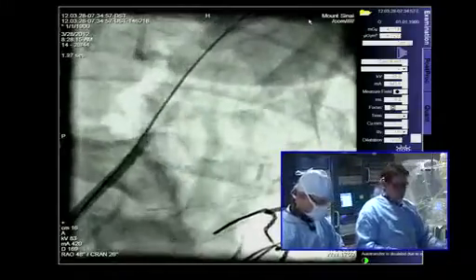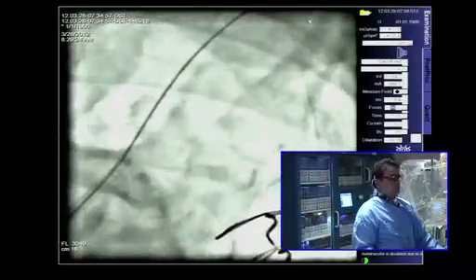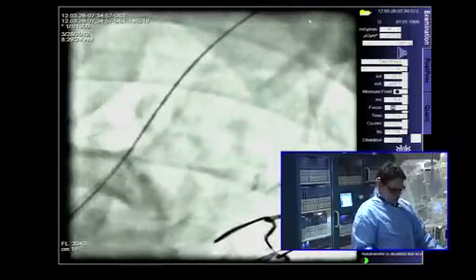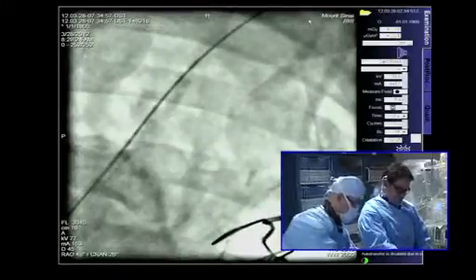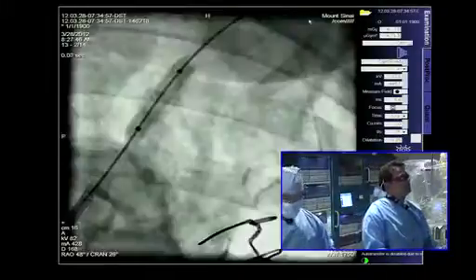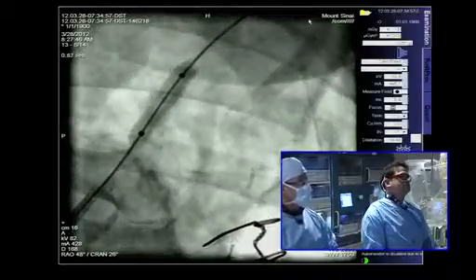As Dr. Christian has said, it is important to choose what type of stent we're going to be using. If it was an aortoostial lesion, definitely we will be using a balloon expandable stent. If we're close to the vertebral, we will also want to use a balloon expandable stent. Otherwise, a self-expanding stent will be appropriate. There's always concerns of stent fracture, for which self-expanding stents obviously have a benefit, particularly when the lesion may be close to the crossing of the clavicle. Otherwise, a balloon expandable stent is more than appropriate.